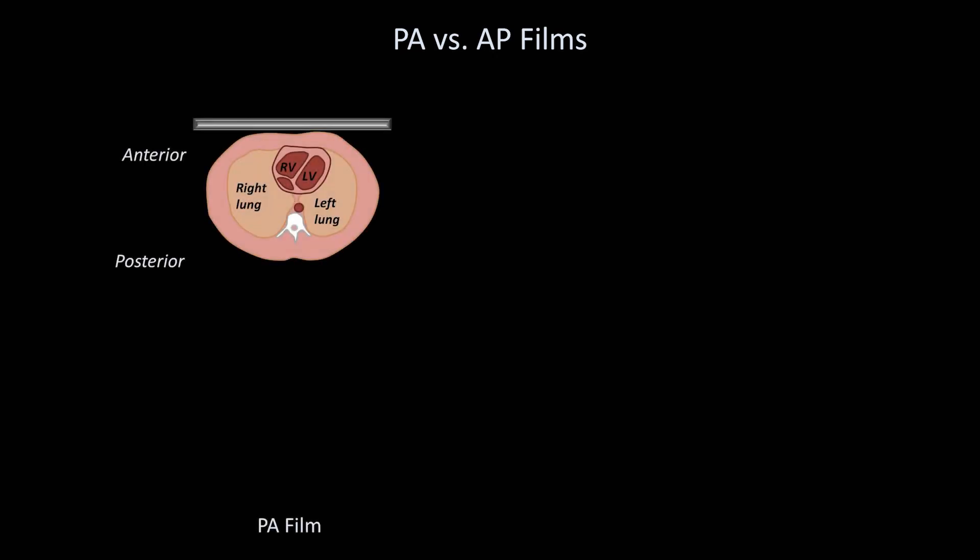Before discussing specific findings, I need to review another very important difference between PA and AP films. Let's start with a PA film — here is an axial cross-section through the thorax at the level of the heart.